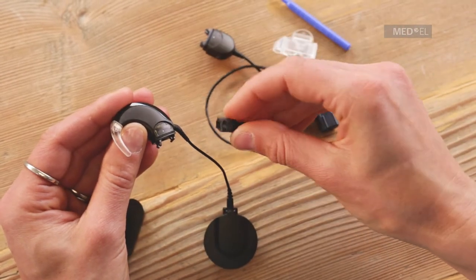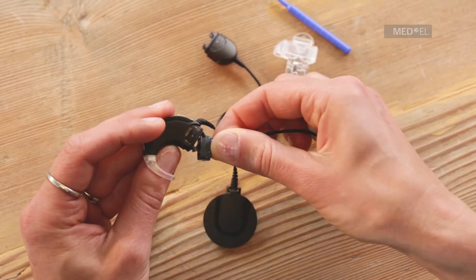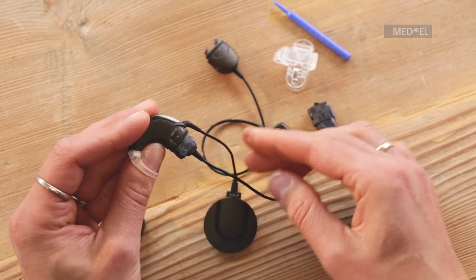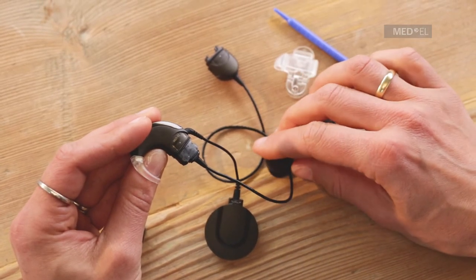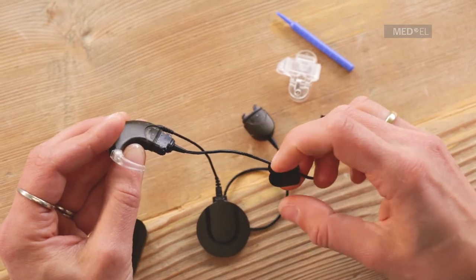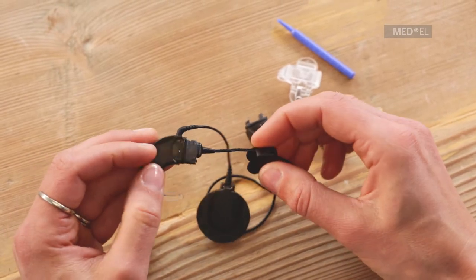To attach the active wear cable, insert the hook on the control unit into the matching groove on the active wear connector and push the parts together until the release lever engages. Slide the cover over the active wear connector and lock it in place.